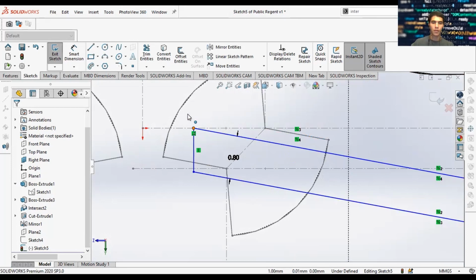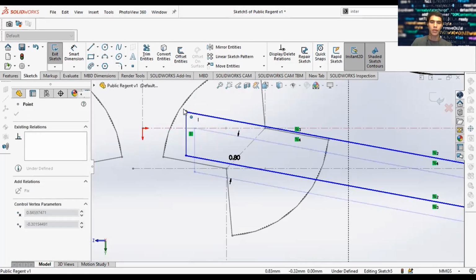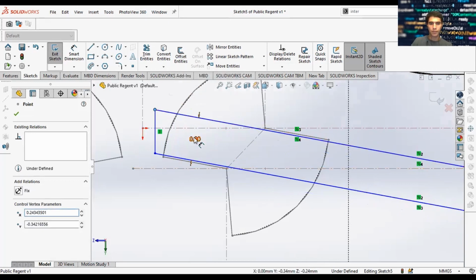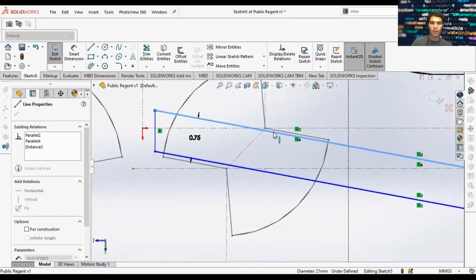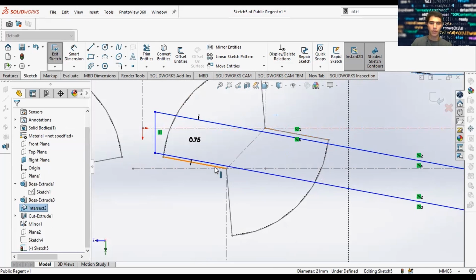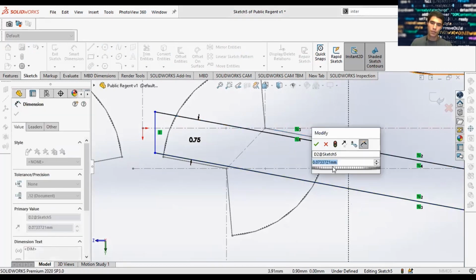And let's measure the difference in diameter between here and here. Okay. So right now what's limiting our sketch, if you see it, is this coincident constraint. So we'll go ahead and remove this, and this will allow us to drag our sketch. So we want to drag our sketch upward here, in between these two conditions. We'll put it centered between our hinges. We have one hinge here and our other hinge here. So what is the dimension here? 0.07.